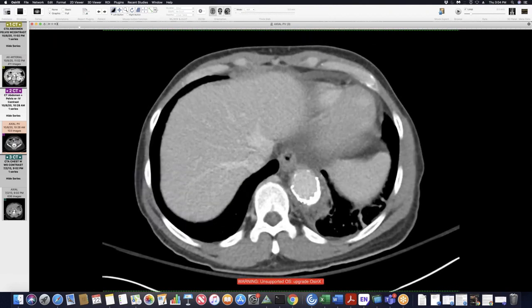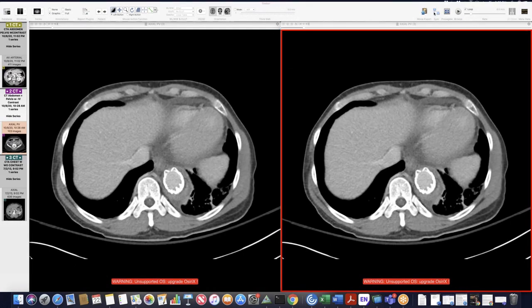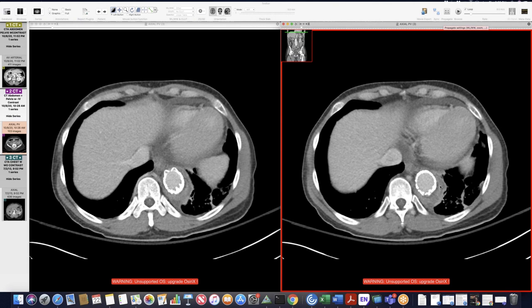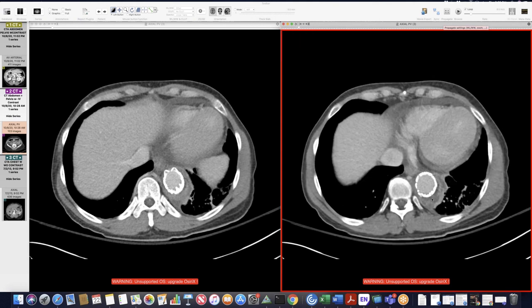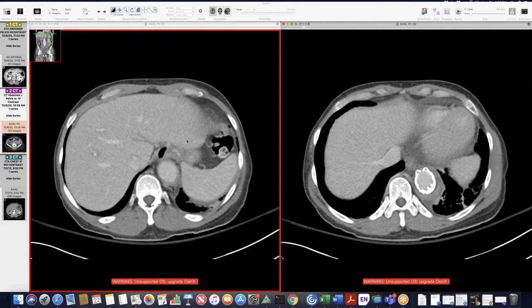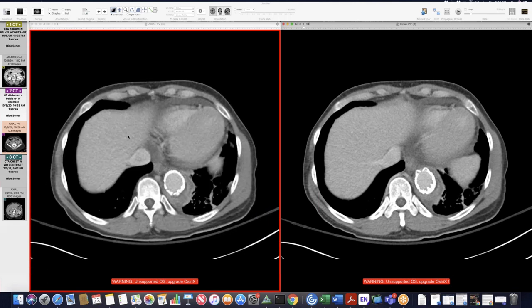And he also had a CT of the abdomen. So on the abdominal CT, the phase of contrast is a little bit later, so I think it shows it a little bit better, but you can see this loculated fluid collection, peripheral enhancement, and inflammation. So this was infected, this is perigraft infection, aortitis. He went into surgery, and then the surgeon drained this. They resected the aorta. This was just basically frank pus.